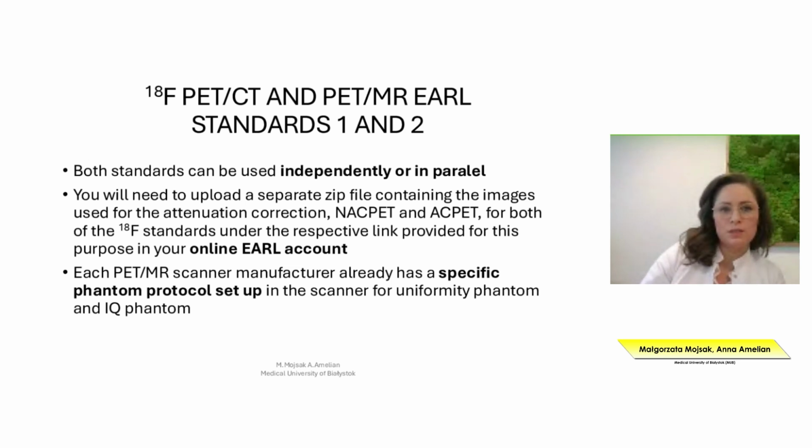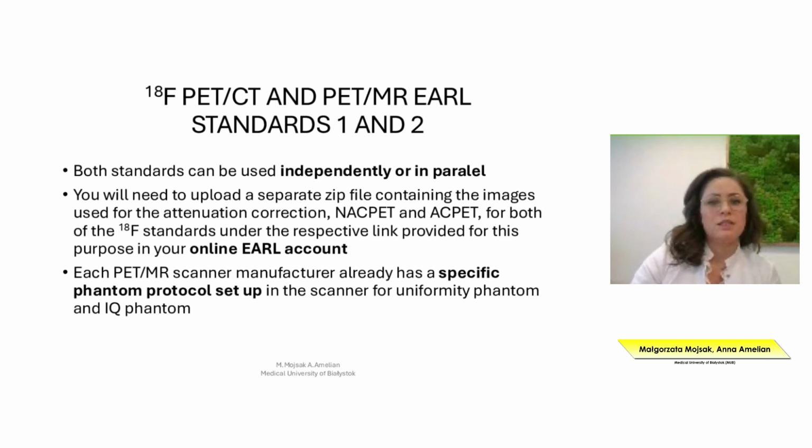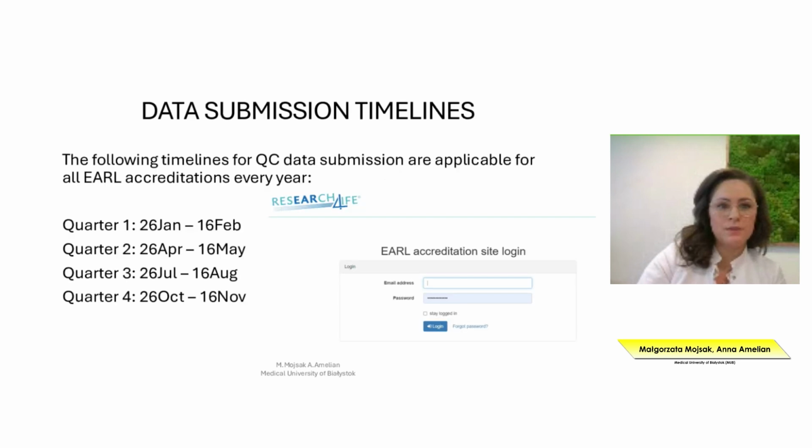So, as I said, we can use them independently or in parallel, so we can have both standards 1 and 2, or just standard 1 or standard 2. It is all done online via the EARL account that we are provided.